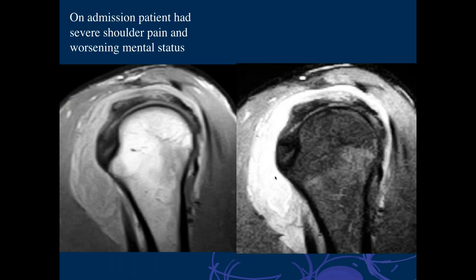An infection all the way around his shoulder. Right. That's what I'm saying. That's what I figure it is. I'm a little biased, but even without the information that Dr. Cruz gave us, I would think that this effusion could not be accounted for by just the rotator cuff tear, especially because there's not that much fluid in the shoulder joint itself. It's called a rotator cuff tear.